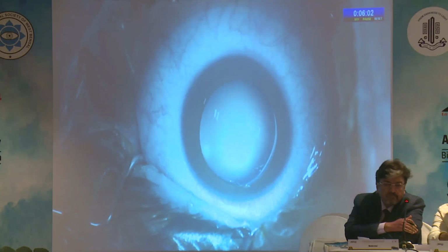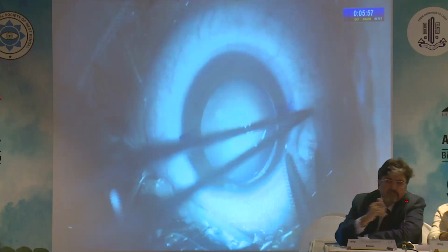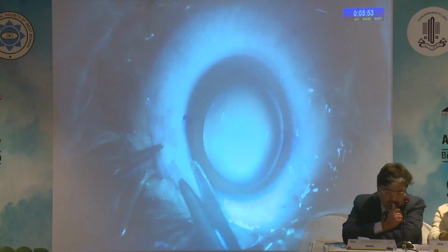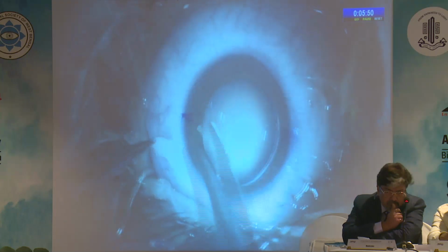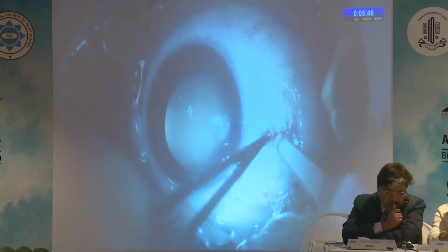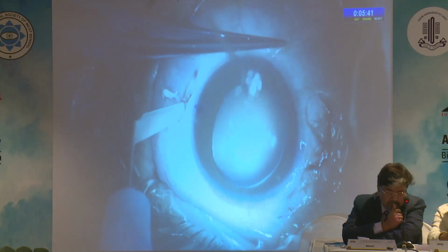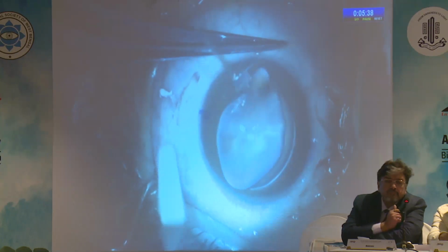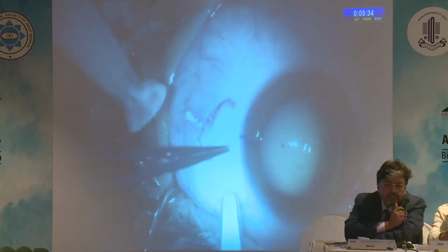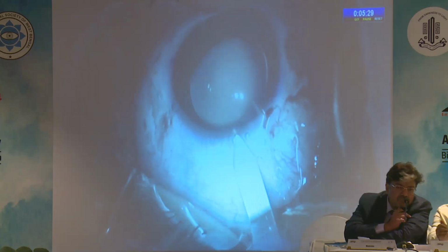We are starting off with a localized conjunctival peritomy at the nasal and temporal portions of the conjunctiva. This would essentially be the area where we would fix the bag with the sclera. We then make partial thickness scleral flaps with a crescent blade, followed by side port and main port incisions.